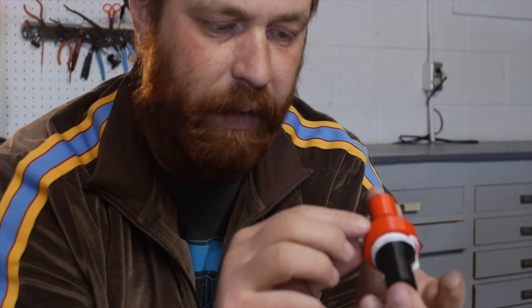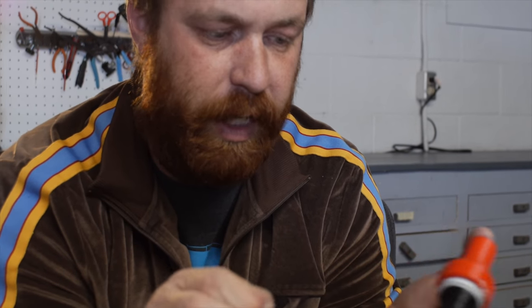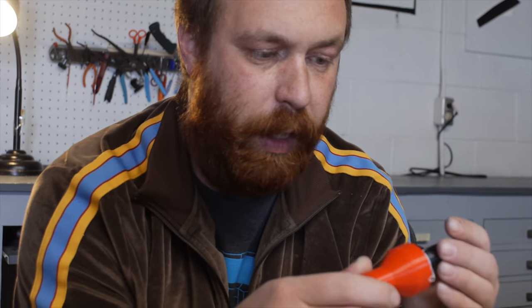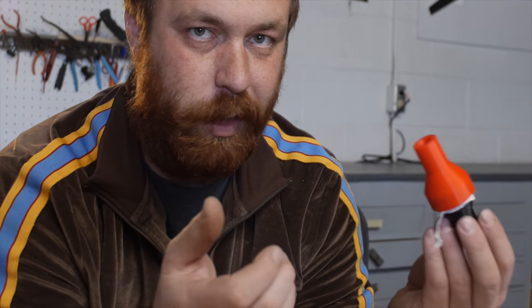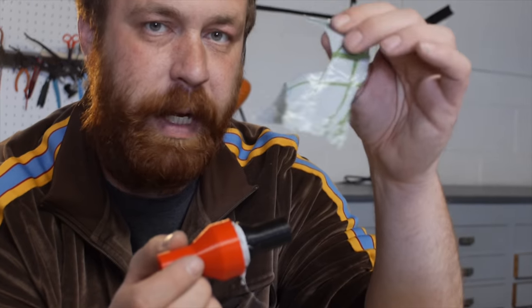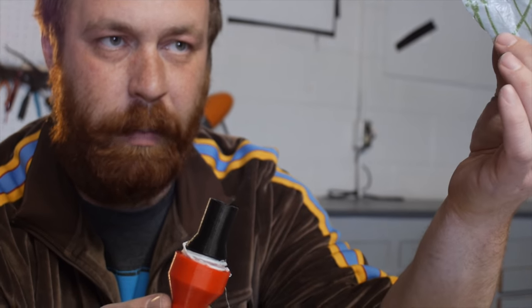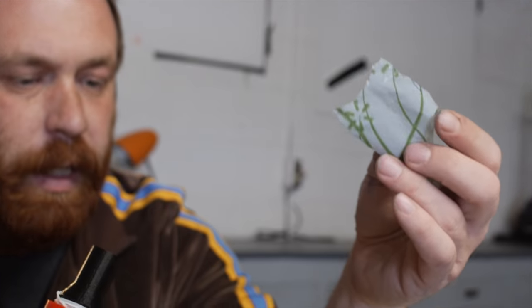Not that you couldn't buy a valve like this at the hardware store, but this does not have industrial oils on it. You can print it out of PLA, which is at least food safe, or PETG, which your milk jug is basically. Right now it uses a piece of a Walmart bag as a diaphragm, but I would suggest using something more food safe. Maybe some people will test it with a food storage bag, a Ziploc bag.